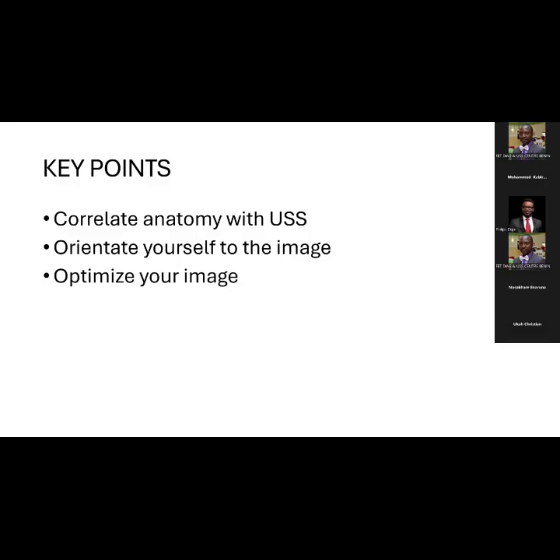Because the way you place the probe, we are taught that the marker should face the right side of the patient, which is on the left side of your screen. So you are going to easily see the right ovary like that. Depending on how the probe is placed, you may have a view of the left as you're going in a panoramic view.